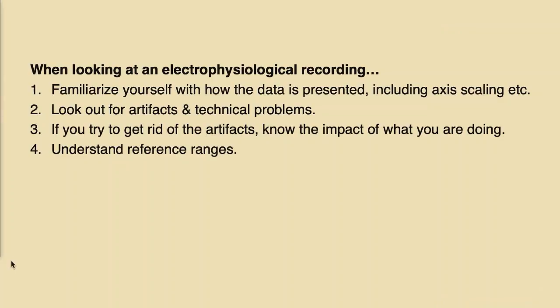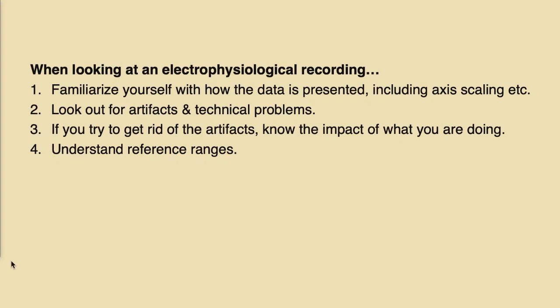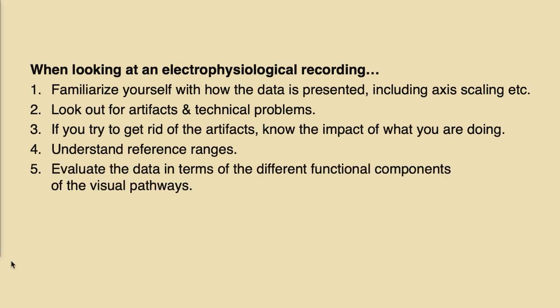You also do something to the real data, to the physiological part of the data, and you need to know what you do. Then usually you should have reference ranges to know what is normal and what is not normal, and you should understand these, and ideally they would be part of the report sheets.